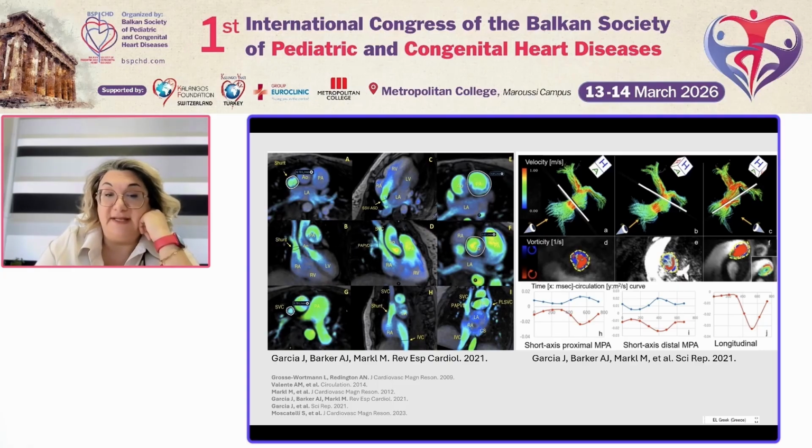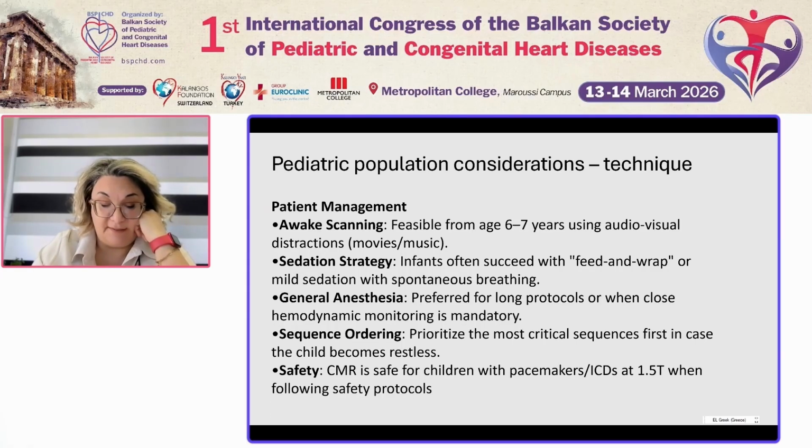Now, in the pediatric population, there are several considerations that need to be taken into account, both regarding patient management and the imaging technique, which must be adapted to the patient's age and level of cooperation.